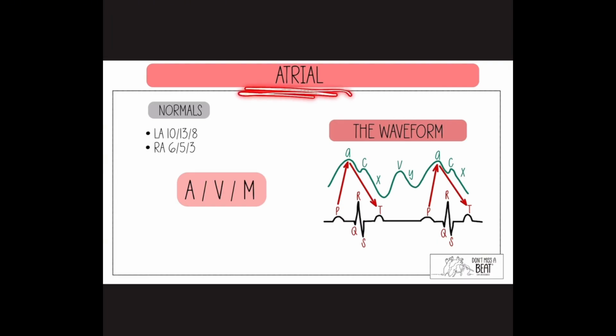Now remember, I said one waveform, so one kind of drawing for 2 chambers, because you have 2 atria, right? You have the left atrium, that's what LA stands for, and the right atrium, that's what the RA stands for.